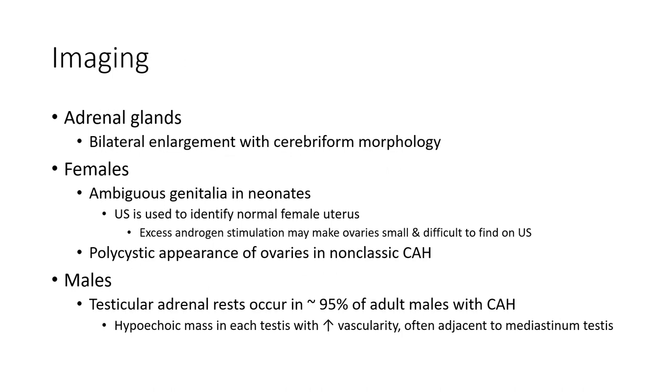Male: testicular adrenal rest occurs in 95% of adult males with CAH. Hypoechoic mass in each testis with increased vascularity, often adjacent to the mediastinum testis.